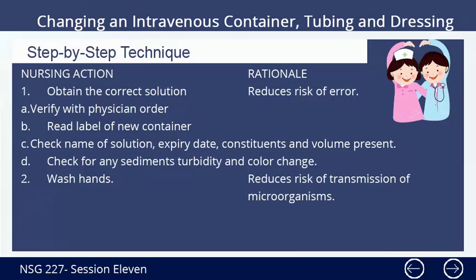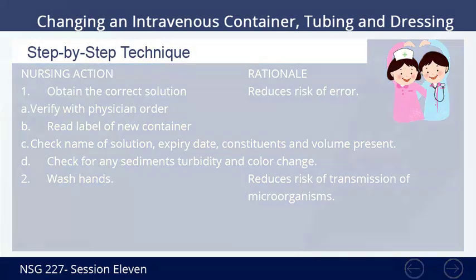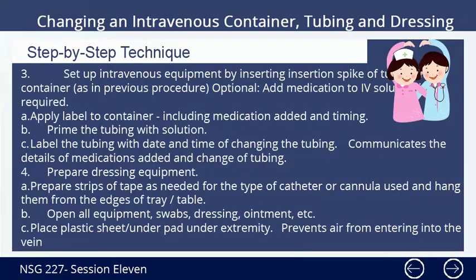2. Wash hands. Reduces risk of transmission of microorganisms. 3. Set up intravenous equipment by inserting insertion spike of tubing into container, as in previous procedure. Optional: add medication to IV solution if required.